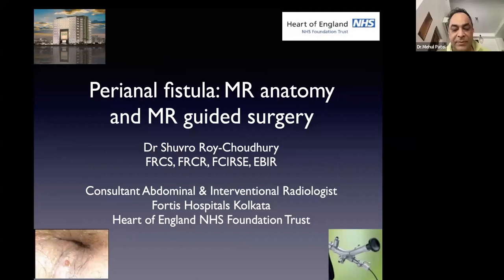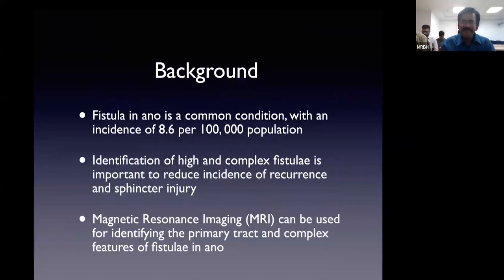This talk covers MRI assessment and the principles of fistula and MR-guided surgical intervention. It is very similar to the talk given last year, with not much change in the content. Yes, it's okay, they are a new batch of students. Let me go with a little background and history; we'll do this over half an hour, 40 minutes.